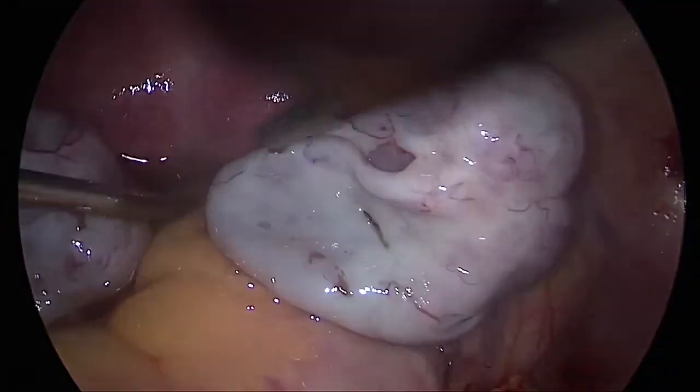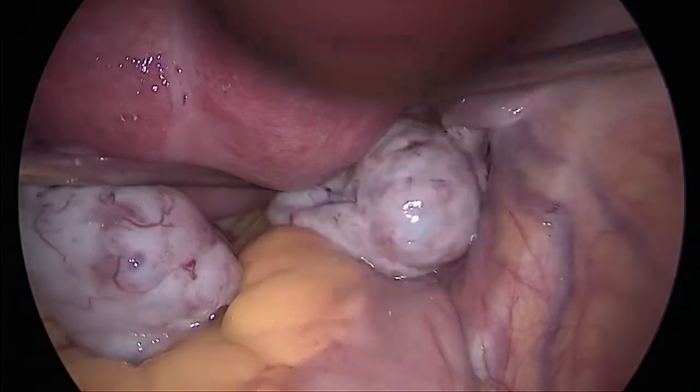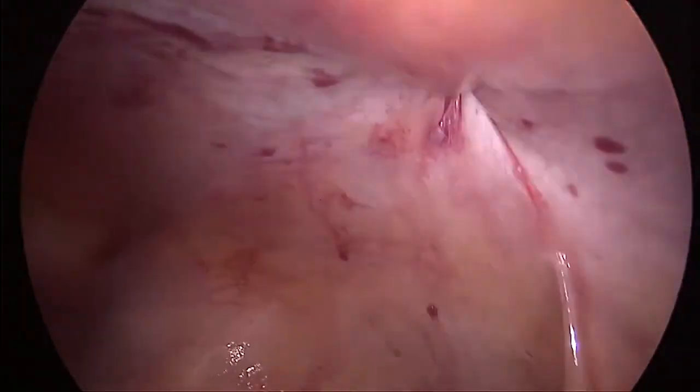Extensive irrigation and suction was done to clear out the hemoperitoneum. The 10 mm port is now closed using a port closure needle.